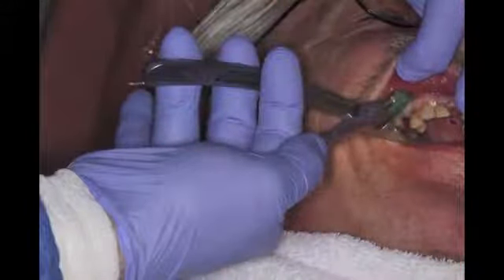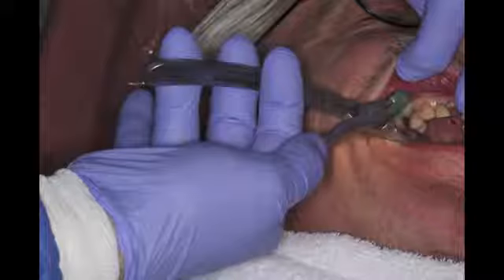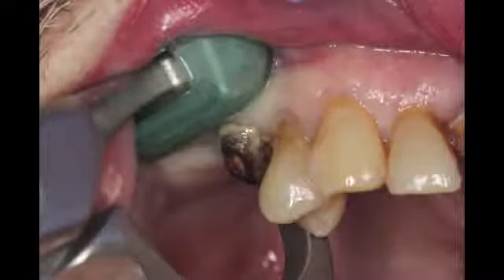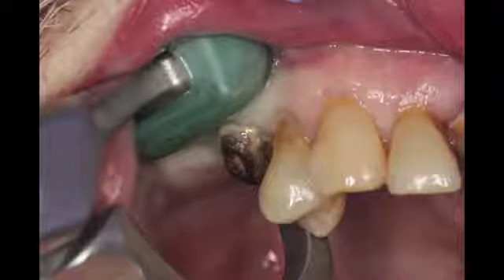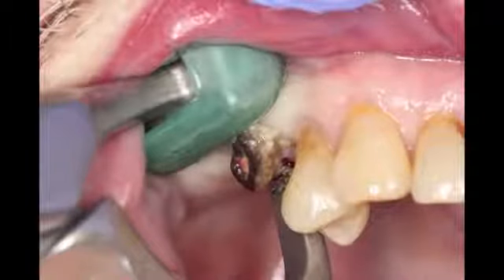So we're engaging the beak onto the palatal surface of a root, creating some type of purchase point, and we will simply hold the handles very lightly. We are not squeezing the handles, so it's rather unique. It's different than a conventional forceps. I'm then going to rotate my wrist towards, in this tooth situation, the corner of the right eye, creating tension on the palatal aspect of the root. The root will then pop and move up and out of the socket.